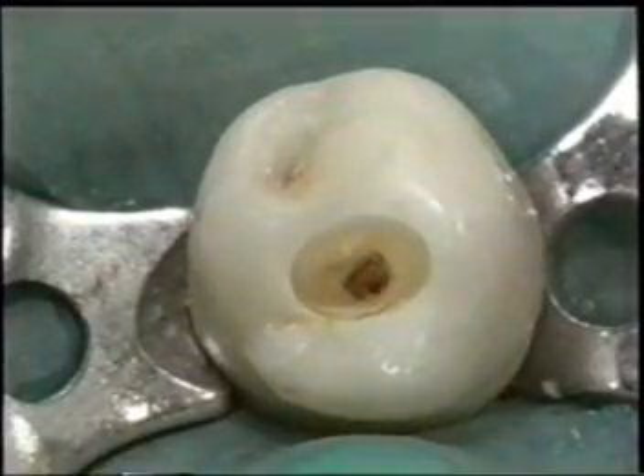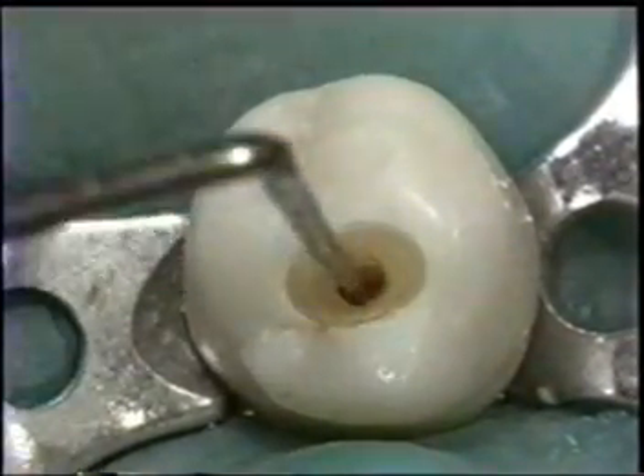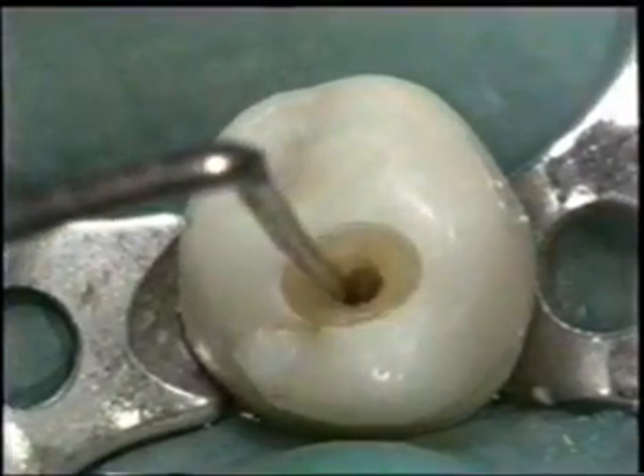Remove the cavity roof with the low-speed burr, always checking with the endodontic probe and searching for a possible second canal orifice.